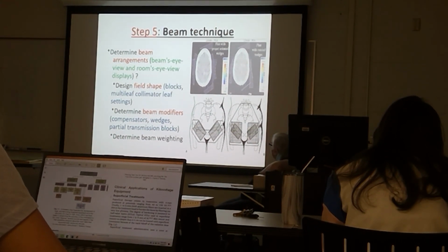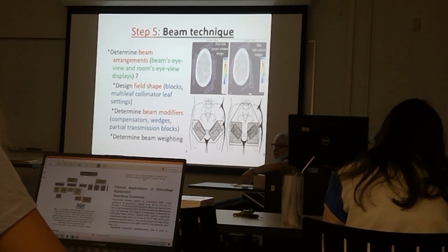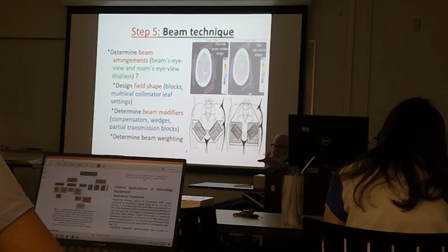This is something probably in the realm of, because it goes down so low, I would say that this is something like a vulva or a vagina, because it goes down so low. And if we're treating gynecological fields, what are we treating here, for example? What do you think this is? This is basic anatomy, guys, not CT anatomy, just basic.